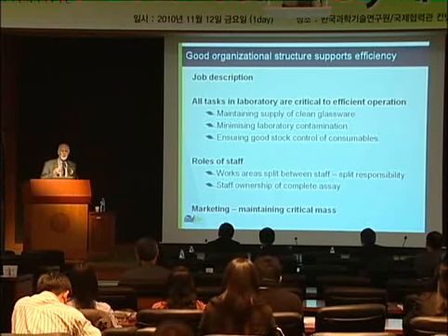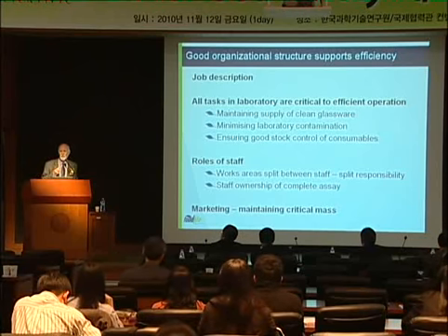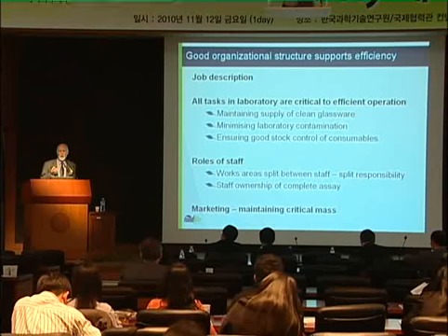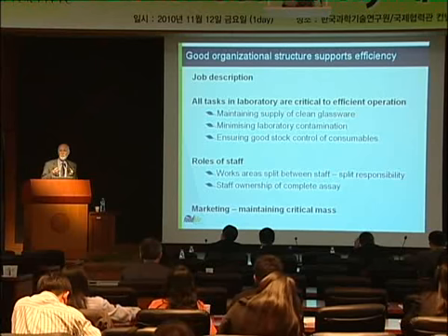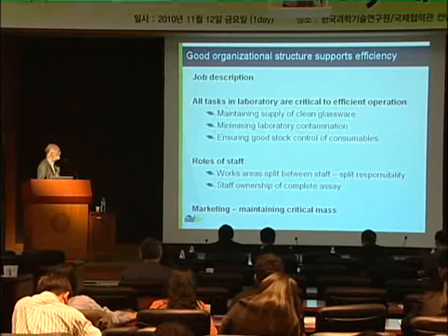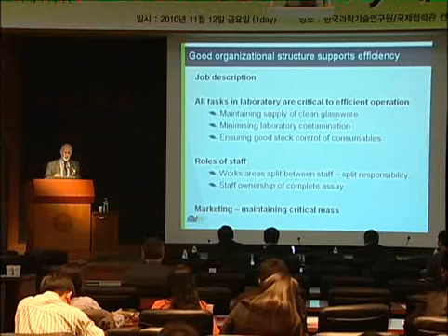During the last dioxin scare, my laboratory received samples of animal feed that were contaminated with dioxins. We also received samples of milk as a result of feeding animal feed to cows. The levels were so high in the feed that everything in the dioxin lab became contaminated. It was impossible to analyse the milk samples at parts per trillion level because of contamination. It's very easy to contaminate labs. It's very easy to have contamination of laboratory consumables and solvents and so forth. This can add costs enormously when you're trying to get back to low background levels.